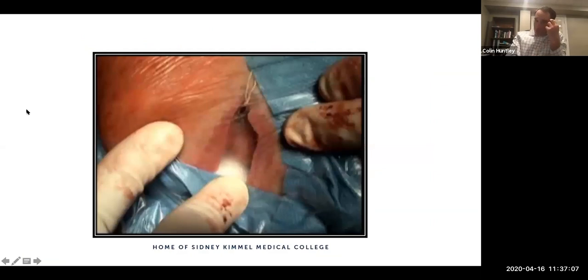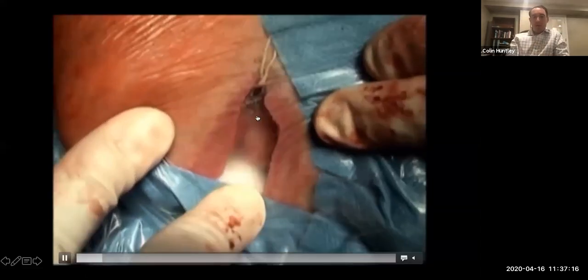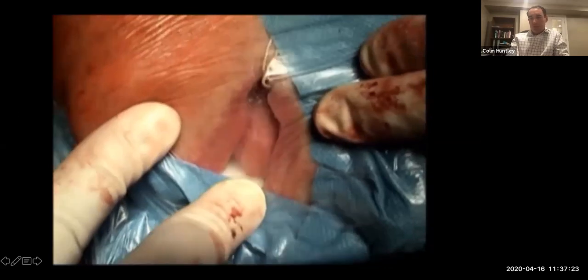And then intra-op, we test the device to look for tongue motion. What we're looking for is stiffening and protrusion of the tongue. You don't want to see the tongue pulling backward or laterally. That suggests that we've included a retrusor branch of the nerve. So this has good motion.